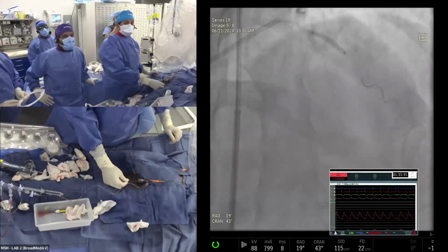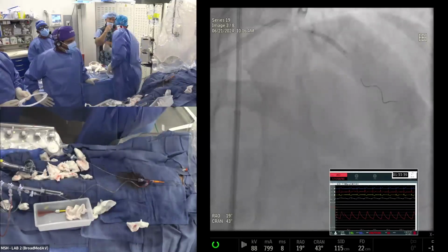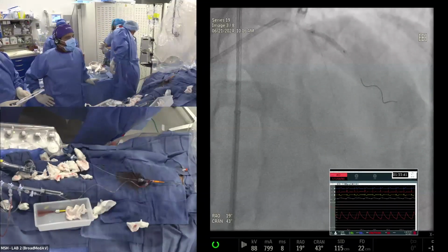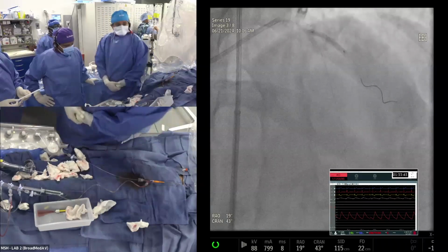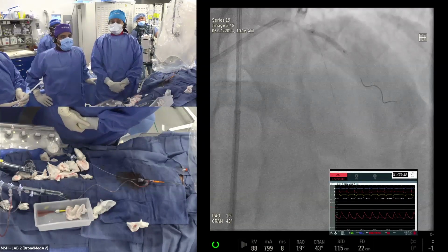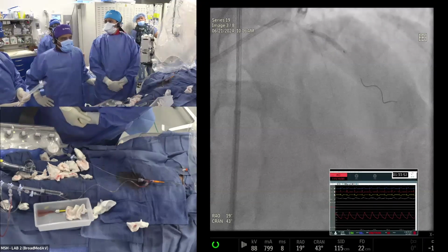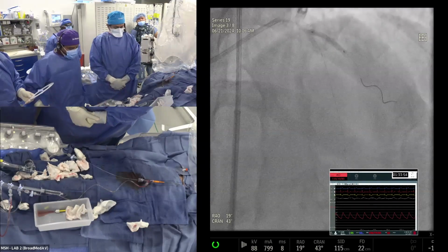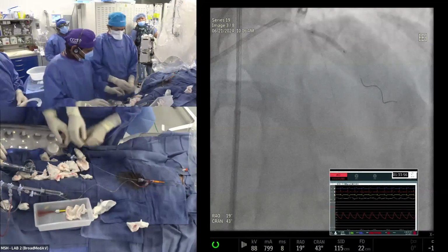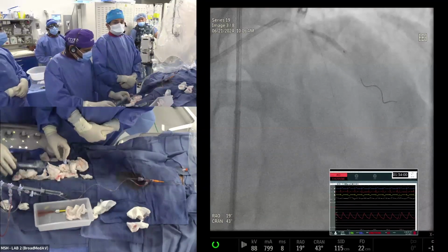You start at 20. Usually we do about 60 to 90 seconds, based on what it is. Do we see any ECG changes? Nothing yet. Actually now we are seeing some ST depression, T wave changes, no ST elevation, and the patient is nicely anesthetized by our nursing team, sleeping nicely, which I always say is a good thing.